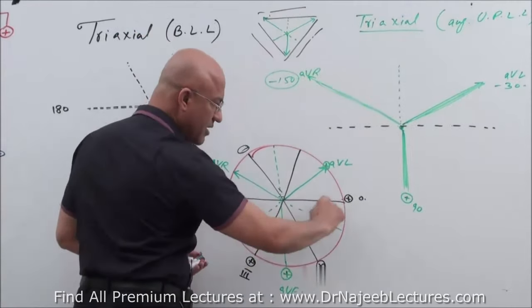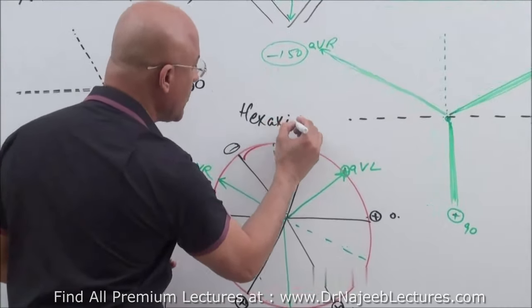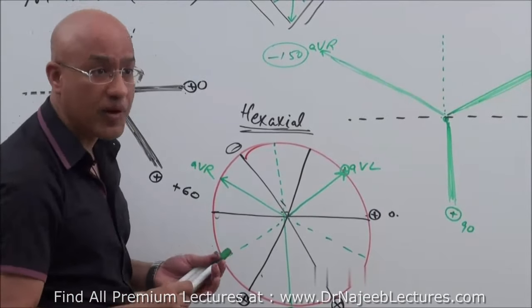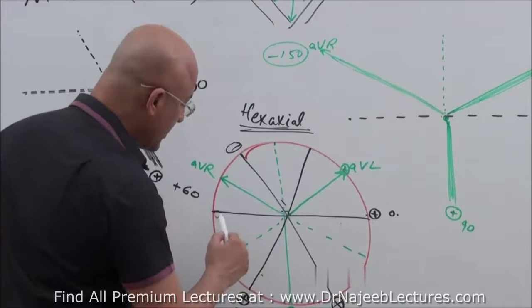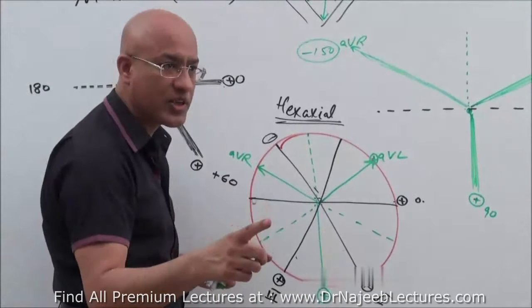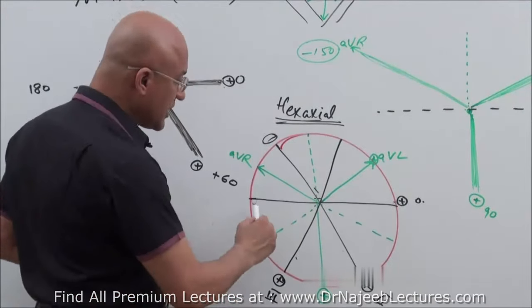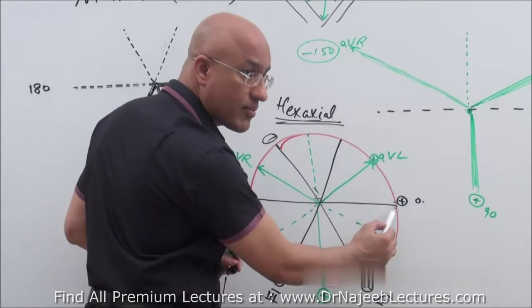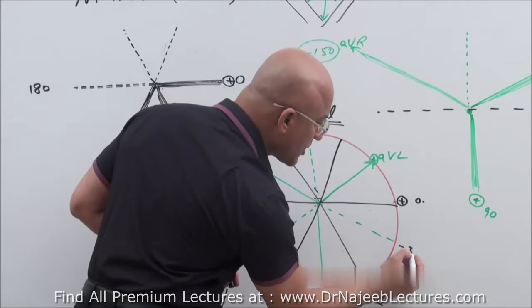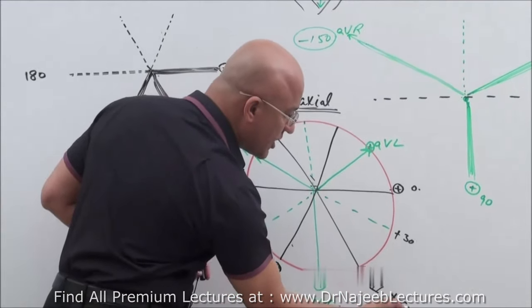What is this lead? Now you tell me again. Lead one. This is now the hexaxial diagram for limb leads in the frontal plane, right? Now it's very important, you should know the orientation of the lead, meaning the angle of orientation, and you must know the polarity of the lead, that is, where the positive pole is. So we can say lead number one is at zero angle. After that, this is plus 30, this is plus 60. And what is this?